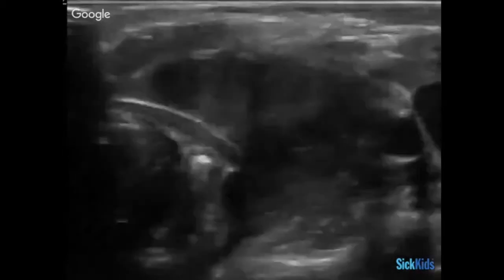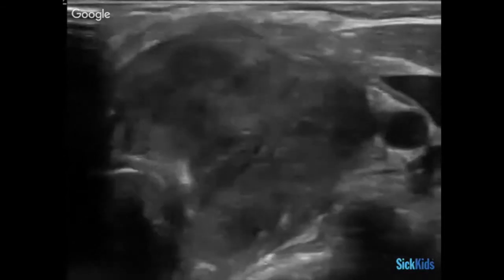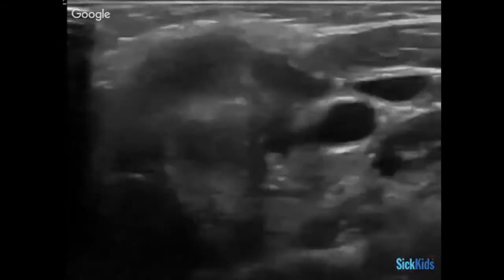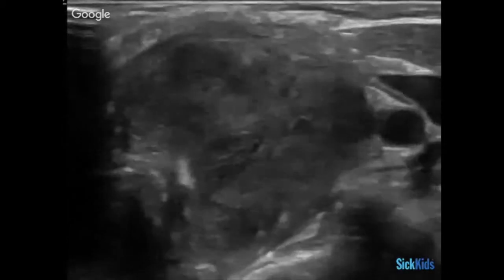Do you just push with your probe? No, I wouldn't push. I would just scan through and see if I see anything inside the vessel, especially anything abnormal. You could put some flow on to see if you see normal flow. But what you're really looking for is something that's abnormal around the site of the infection. Okay, so those are pretty simple core concepts around the spectrum of disease.